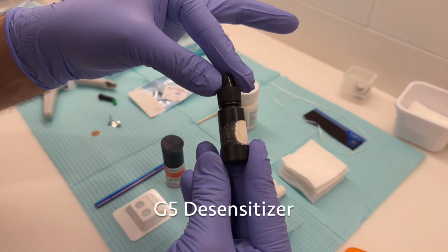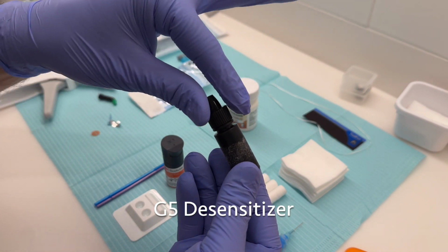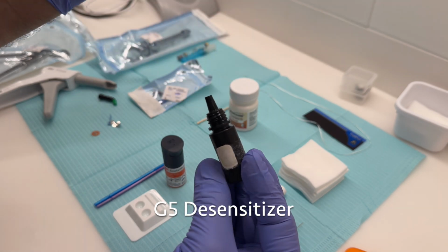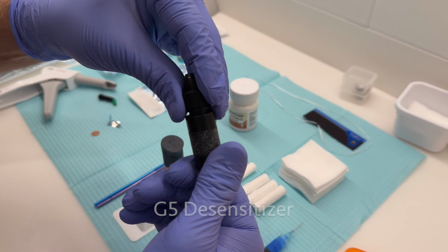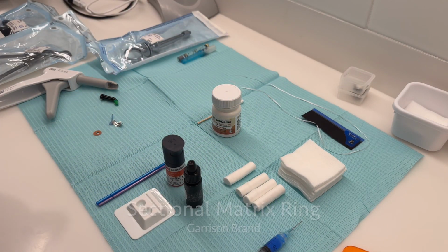This here is our G5 desensitizer. Not every dentist will use this. Some dentists swear by it. This is simply just a varnish or desensitizing layer that's used for the cavity prep. This prevents any mechanical or physical irritation.